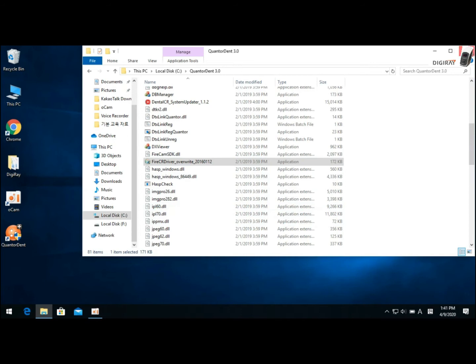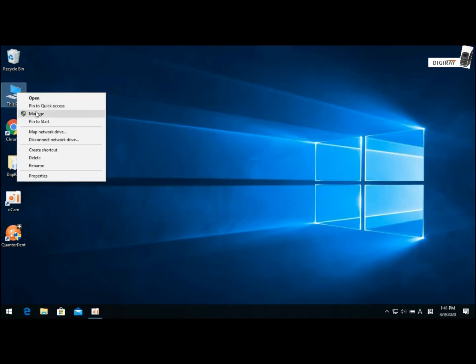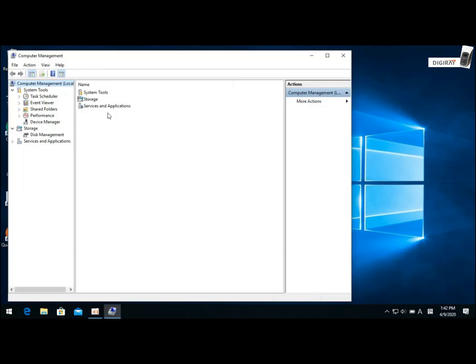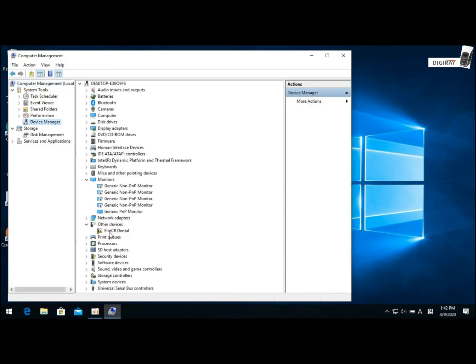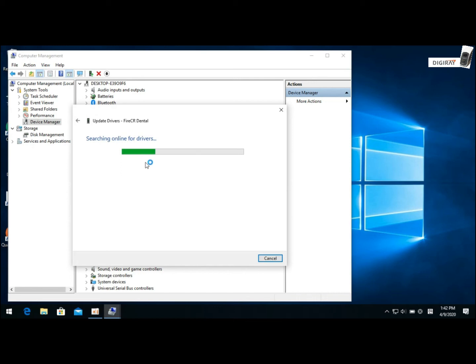Once it's done, open the device manager again. There, click Fire CR Dental, then click this green arrow, and select Search Automatically.